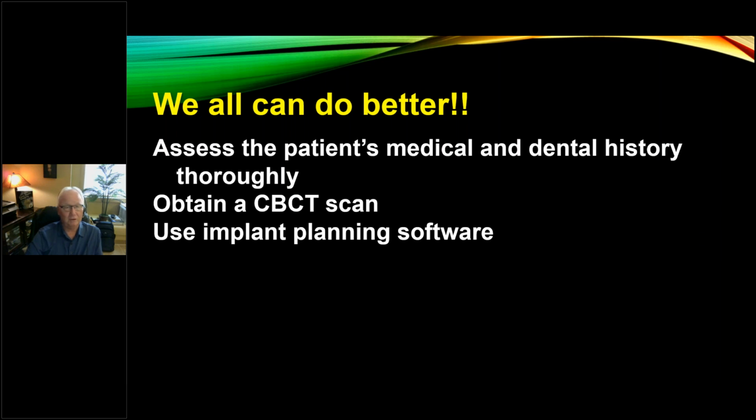Get them functionally restored so that they can be good again. Chewing. I think you should, and even those folks out there who may not be using a guide that have been doing implants for years, if you're long past the learning curve, fine, more power to you. But when you start using a surgical guide and use it in a protocol, it's not difficult. You image one week, do your surgery the next, or two weeks later, whenever you get the guide back, and it makes it so easy.